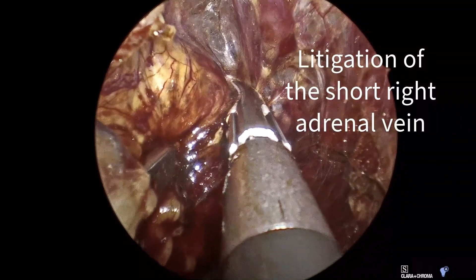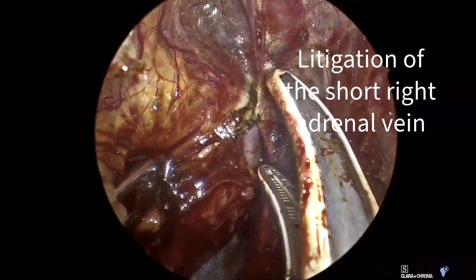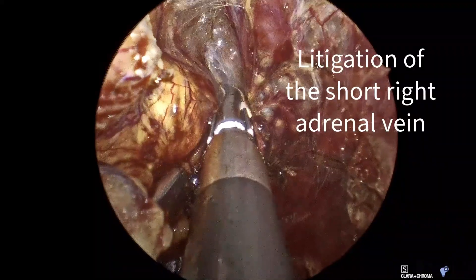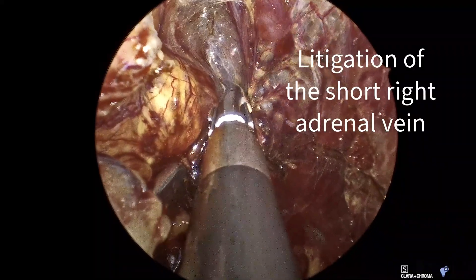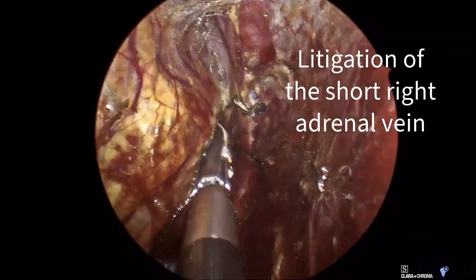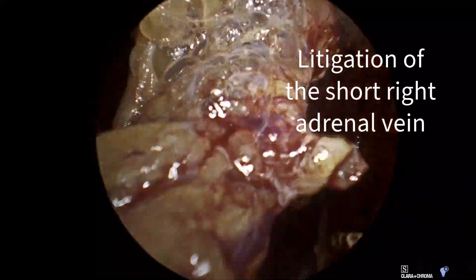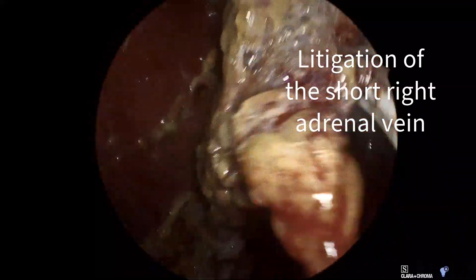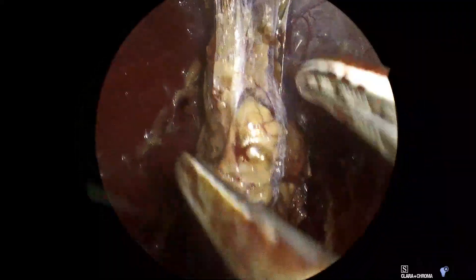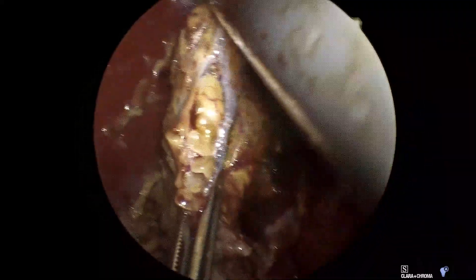Here I'm ligating the short right adrenal vein using the ligature device, and meticulously peeling the tumor off the vena cava.